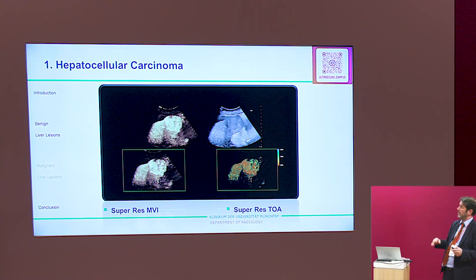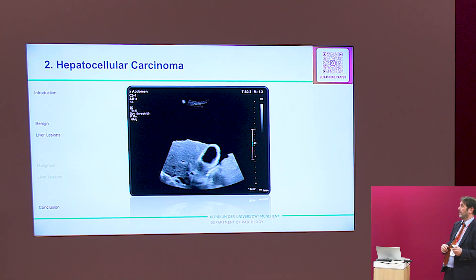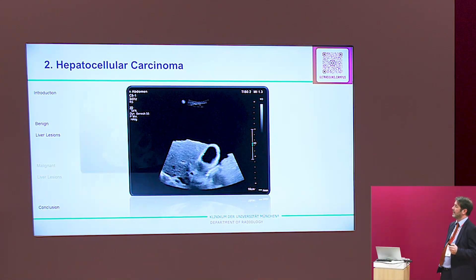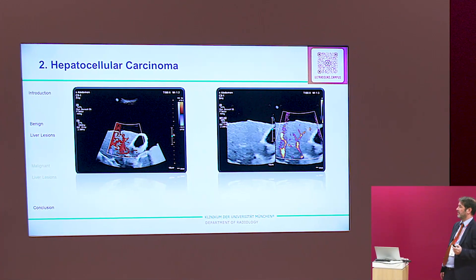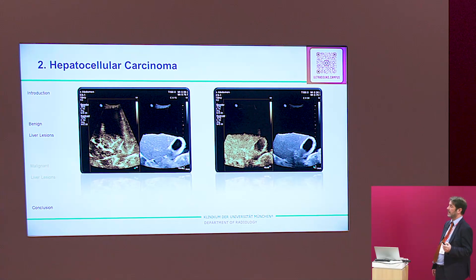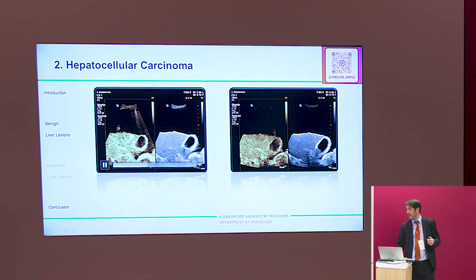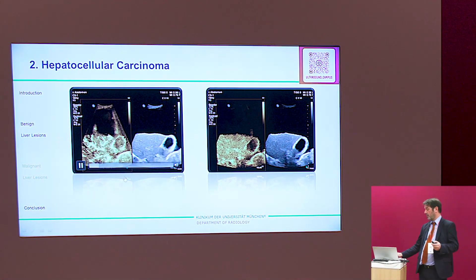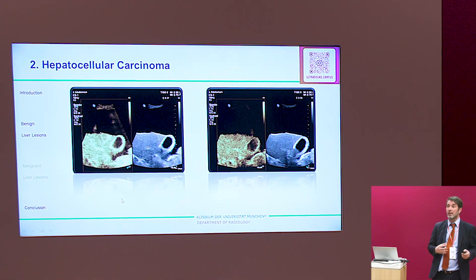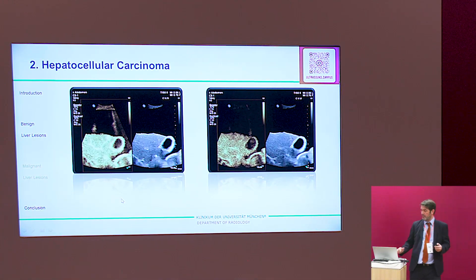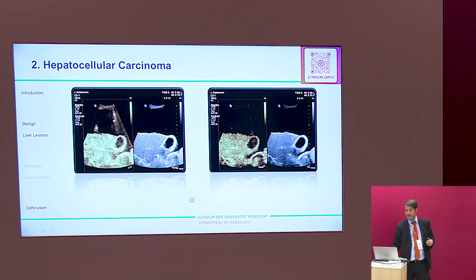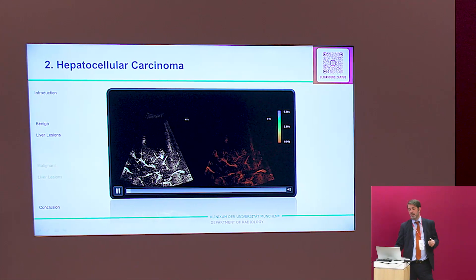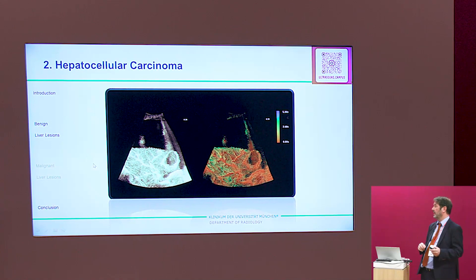Looking at the time-of-arrival image side by side. Can you see a lesion in this grayscale? Perhaps a tiny lesion. We optimize with color Doppler and power Doppler — difficult to see, but a tiny lesion is visible. There it is: a tiny HCC with a diameter less than one centimeter. The best outcome for a patient is to detect it this early. In the later phase the lesion is still visible. We are also able to detect very early HCCs using this technique — the grayscale is difficult, but with contrast, clearly seen.